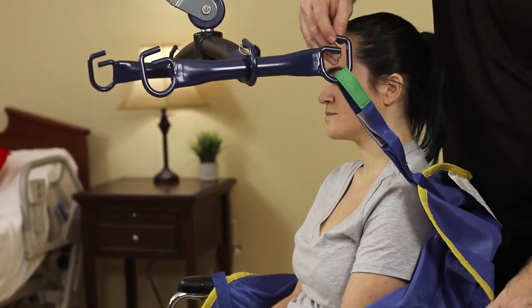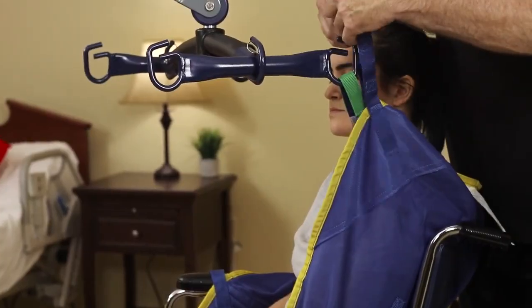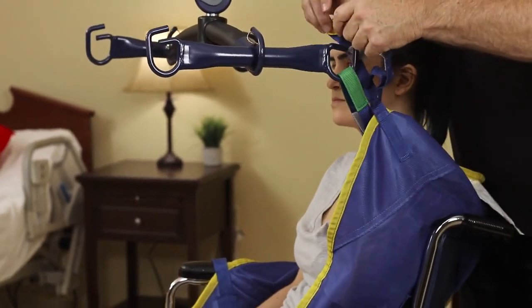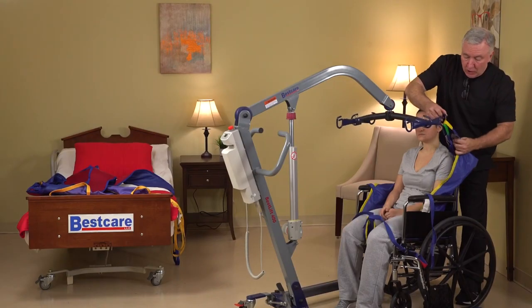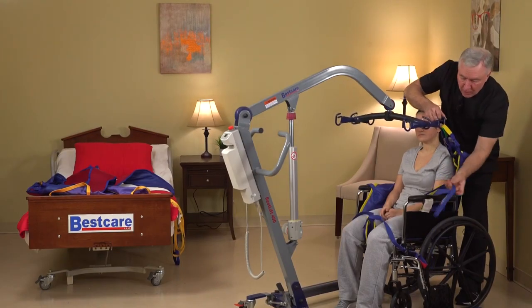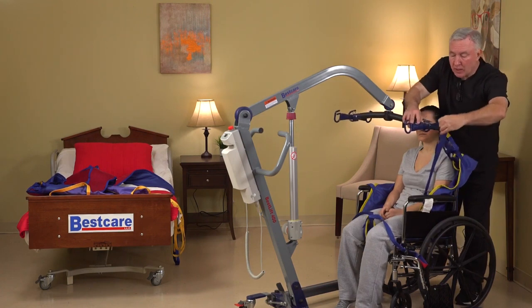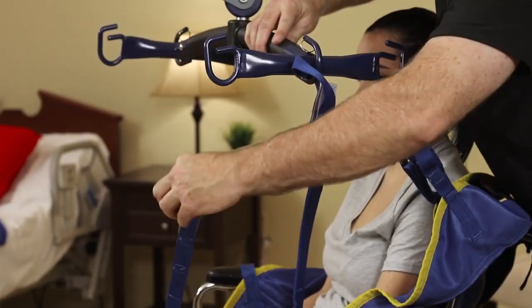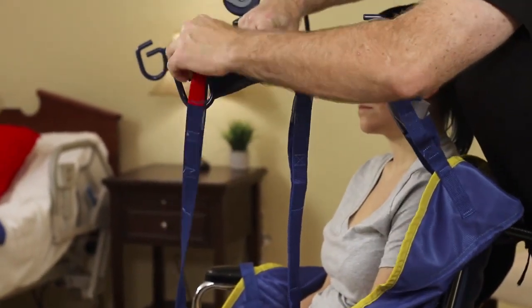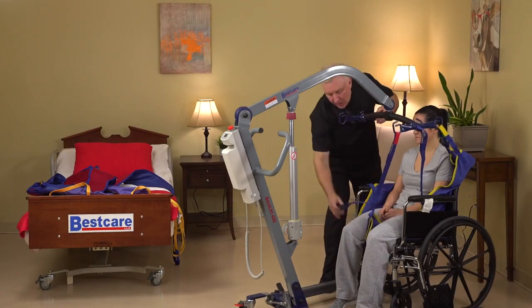And now I'm going to show you that we can connect the first set of loops to the first hook, the second set to the first hook at the same point. So you can see green was here, and this is the longest one here is yellow. Then I'm going to hook the third set of loops to the middle hook at the same level, and then the fourth at the same level as well. So now we're going to repeat that process on the other side.